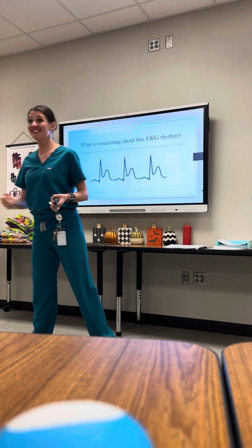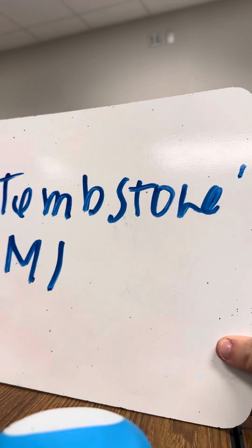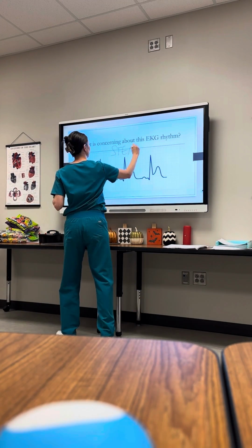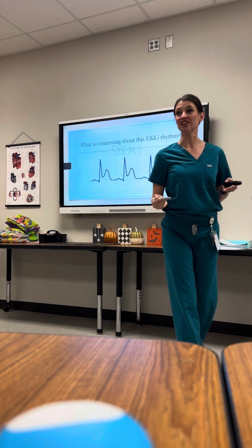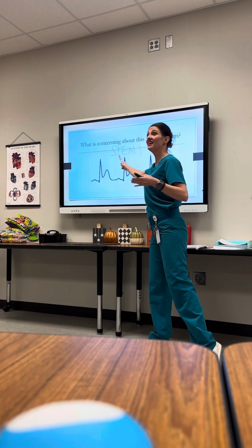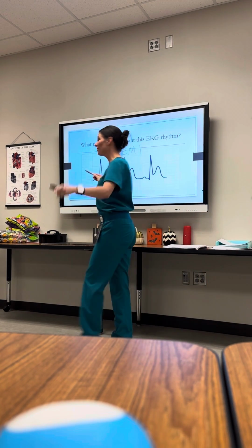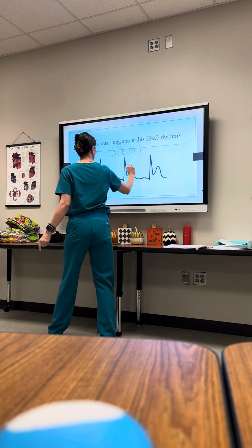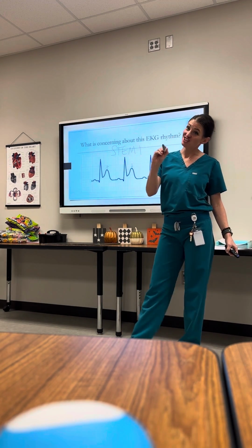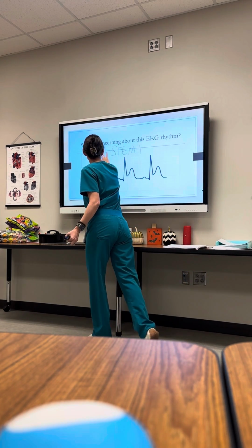Did you write it? Okay, the word I want to see on your board is STEMI. It's technically an abbreviation, and it stands for ST elevation myocardial infarction. And some of y'all wrote tombstone. You're right. Looking at some tombstones here. J point not looking good. That's right. Okay, very good.